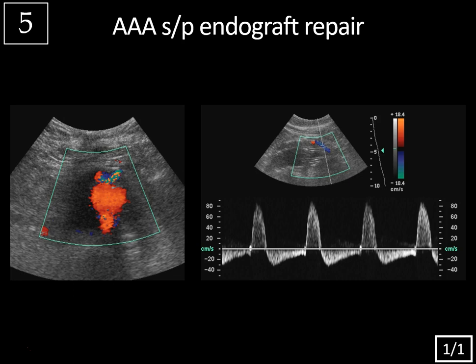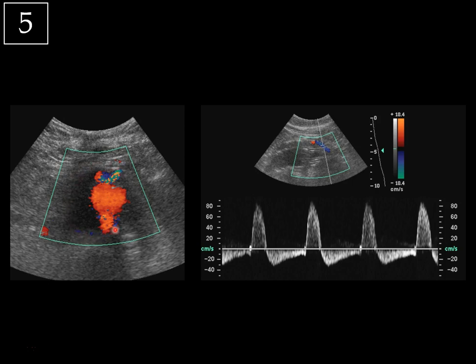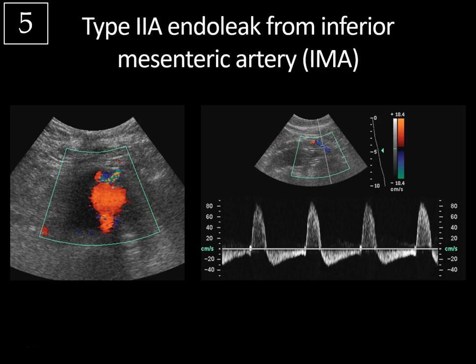Case 5: ultrasound from an abdominal aortic aneurysm status post endograft repair. On the transverse image, flow within the endograft is normal, and there's no flow within the excluded aneurysm sac — also normal. However, there's a tubular area anteriorly with very turbulent flow. On the sagittal color image it's tubular and linear, extending outside the aneurysm sac. The spectral Doppler waveform shows a to-and-fro pattern — retrograde diastolic flow then antegrade systolic flow — bidirectional flow going in and out of the excluded sac. This is typical for a type 2 endoleak from the inferior mesenteric artery.